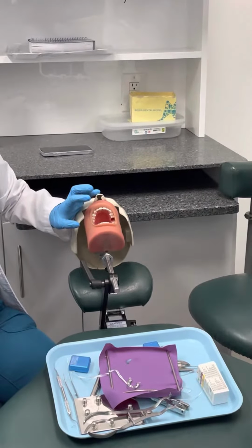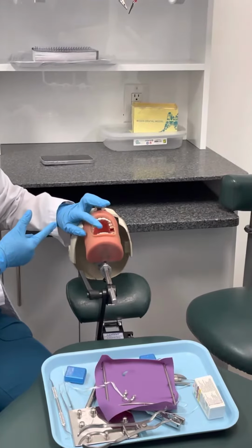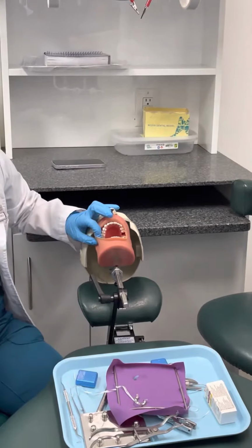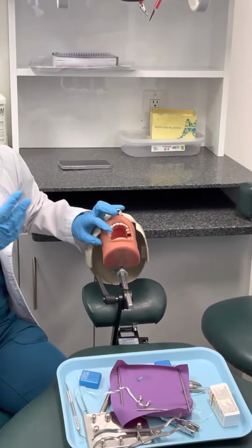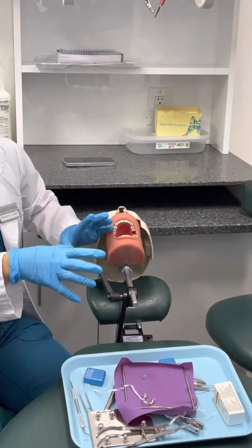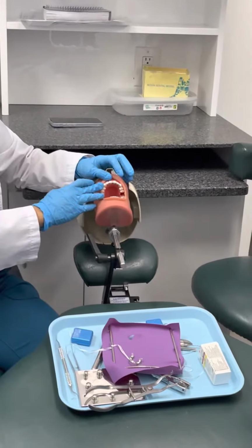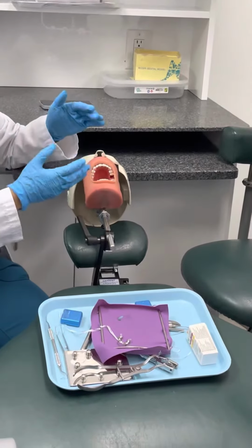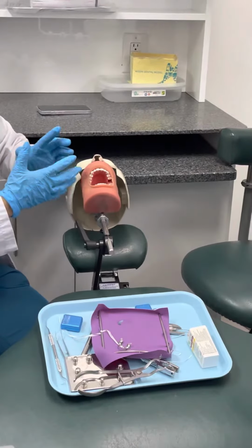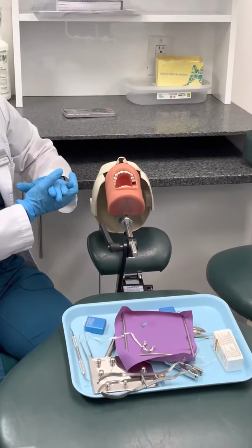What other condition of the mouth can you not use a dam? One is inflammation, gingivitis. The more that you have to put the dam, so the gingiva is not exposed. But you cannot clamp the tooth. If the rest of the teeth have gingivitis, then that's okay, because you just have to be careful putting it in. It's okay because you have to cover the gingiva you're working on, so they're not going to get sensitive.